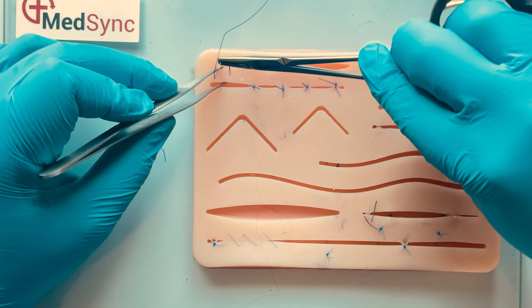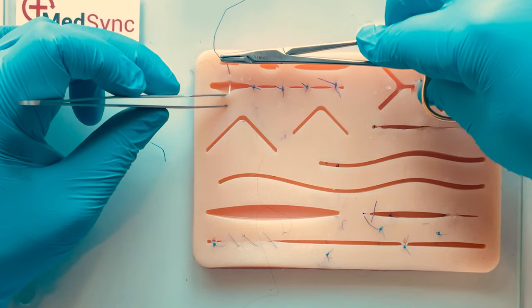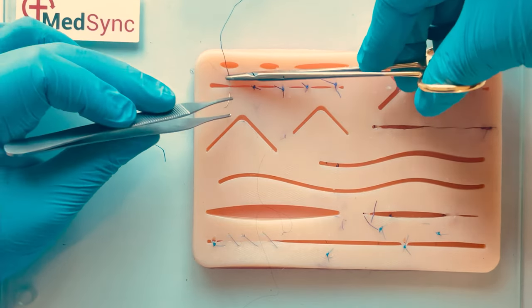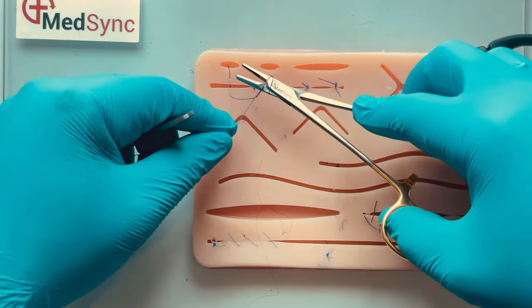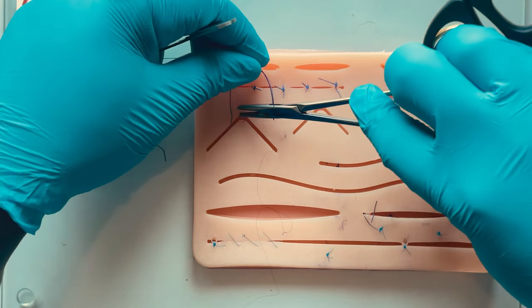When you place your sutures across a wound ensure they are evenly spaced at the same distance from the wound edges on both sides and the knots lay on one side of the wound itself.